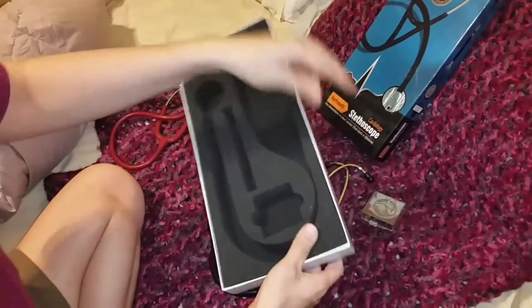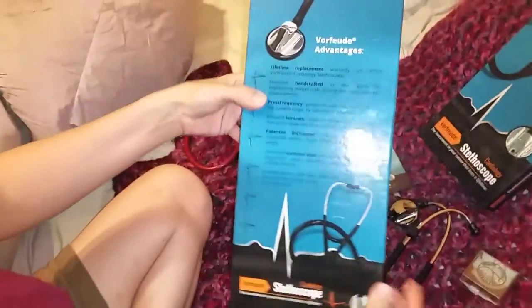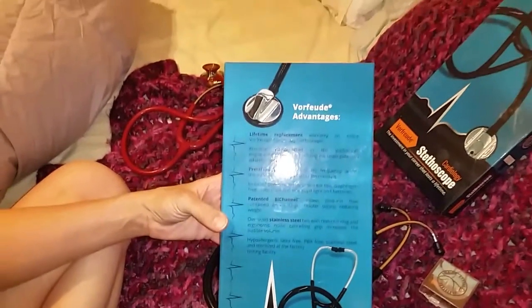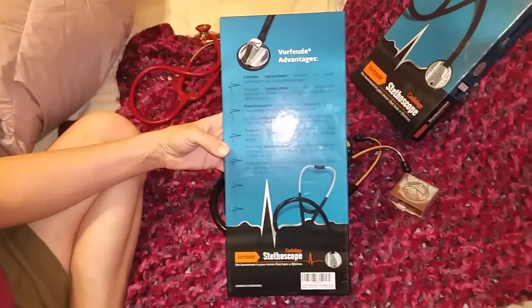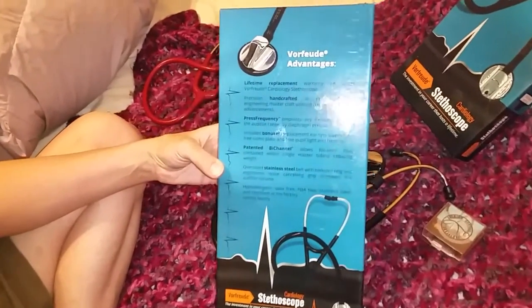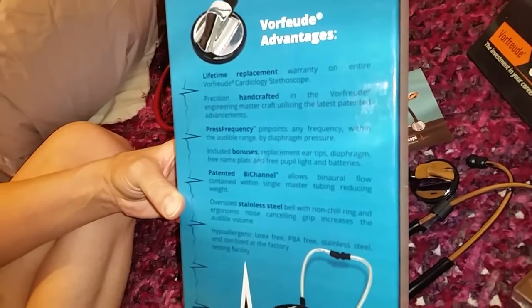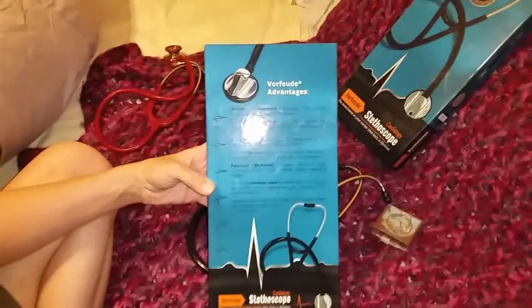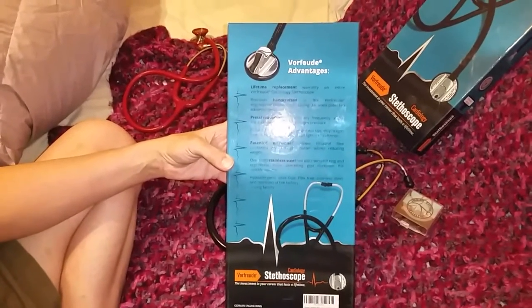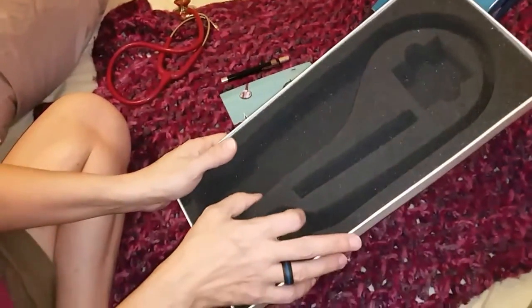This comes very well packaged, with more information on the back. Even greater bonus: the stethoscope has a lifetime replacement warranty on the entire stethoscope. This can pinpoint any frequency within the audible range. It has the bonuses of replacement ear tips, the diaphragm, the nameplate, and the penlight — and it comes with the batteries, so you are ready to go. Hope that helped. If you have any questions, just leave them below.